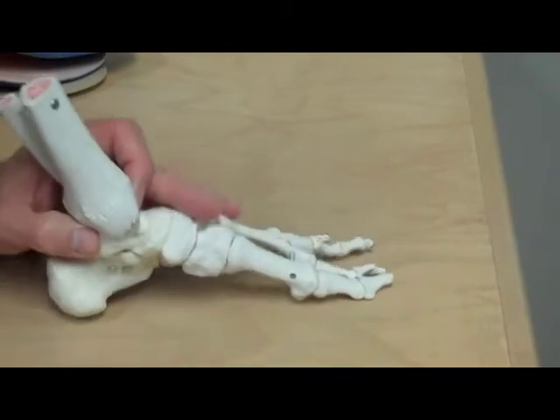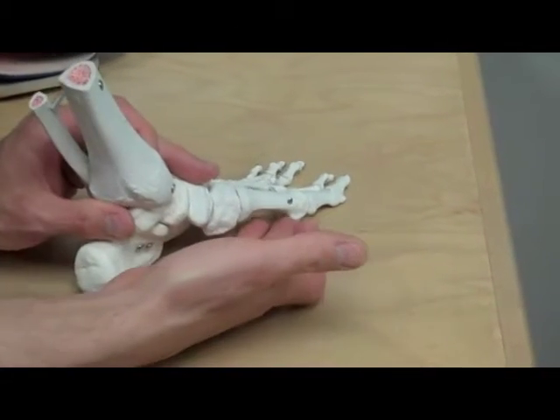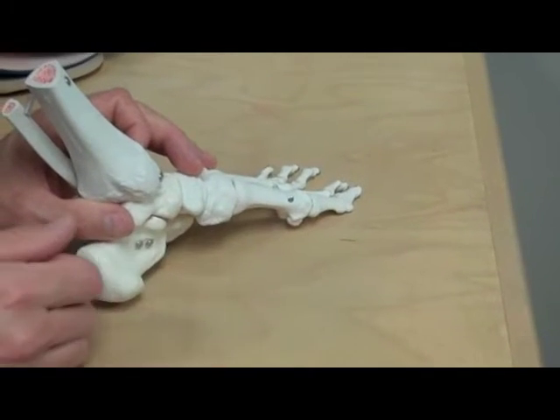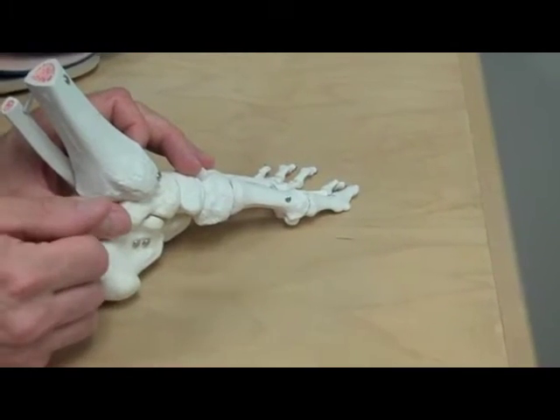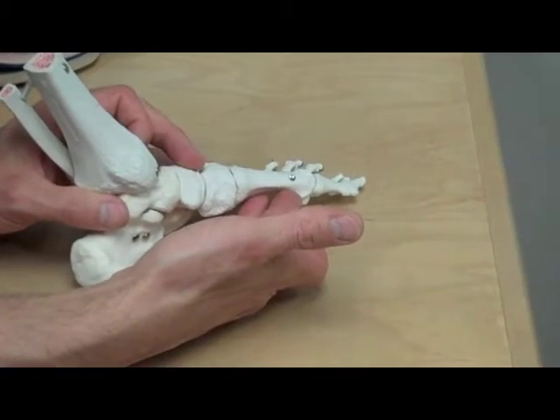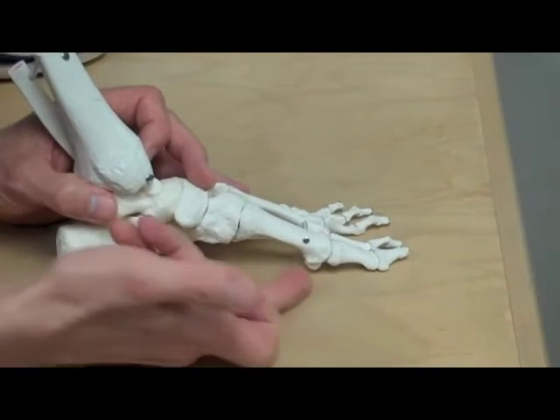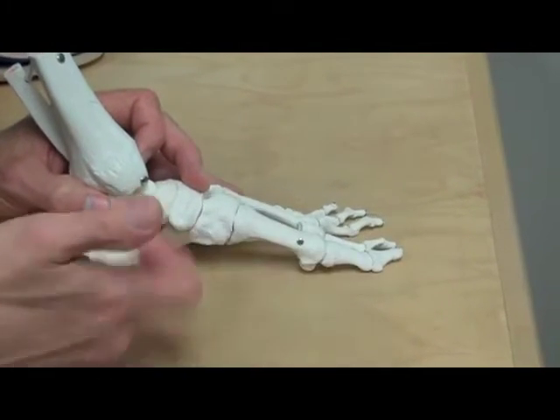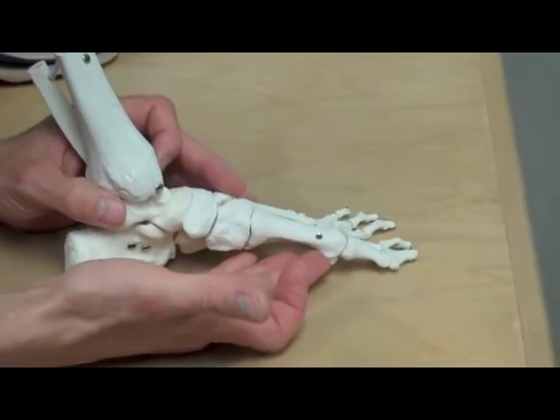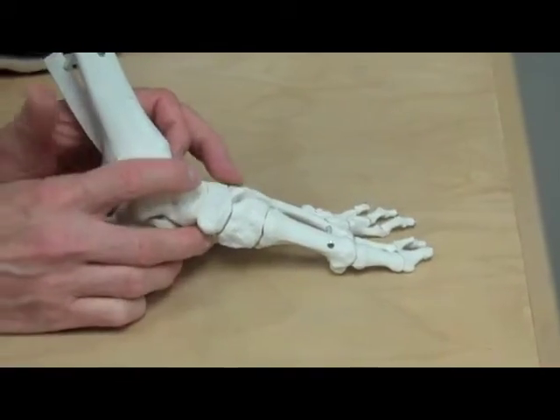Okay, what a lot of therapists do is they load it in the opposite direction. They have a flat foot that's rolling in, so they really try to build this up so it's higher here than over here. For plantar fasciitis, that's not the best thing to do because research tells us that by having this higher than the outside, it actually loads the fascia more and causes more pain. So if your orthotic is thicker here, because of the way your therapist or your orthotist or podiatrist made it, that's not the best way to treat plantar fasciitis based upon the evidence that's out there. Okay, so it's just the opposite.